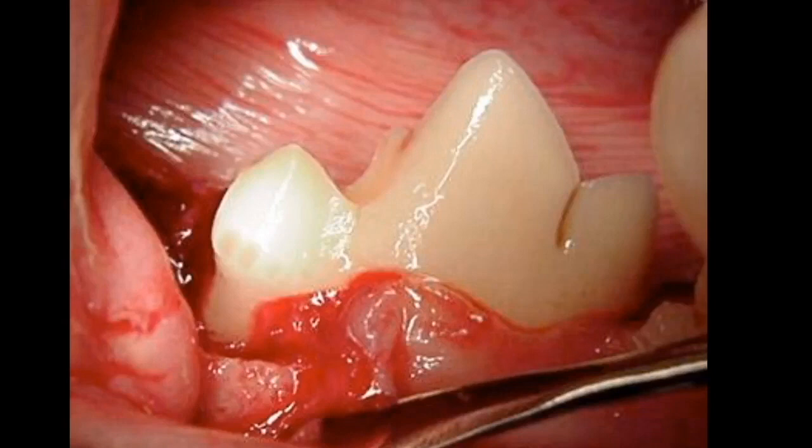And so we'll clean all that all the way around, make sure that there's no granulation tissue down in there using our curettes. And another thing that I use that I don't know a lot of you realize, or that we've talked about before, is a fine cylindrical diamond burr.